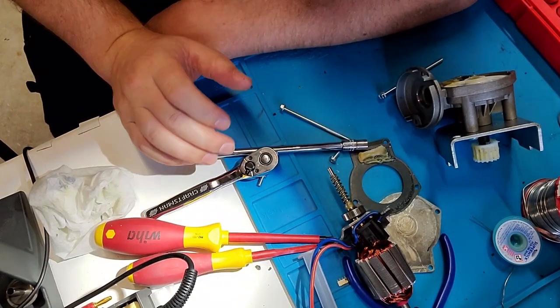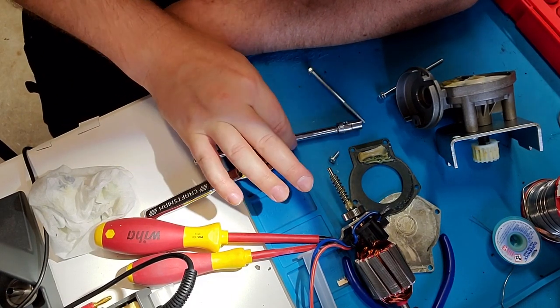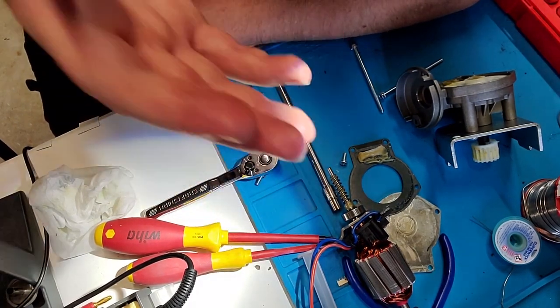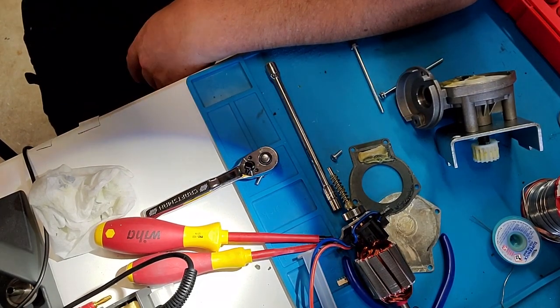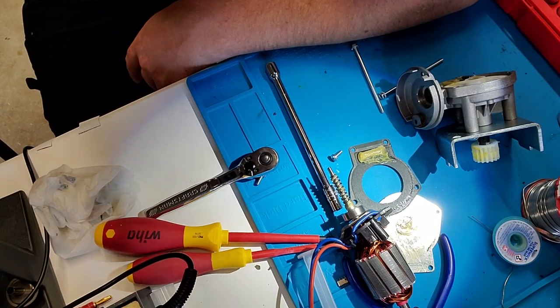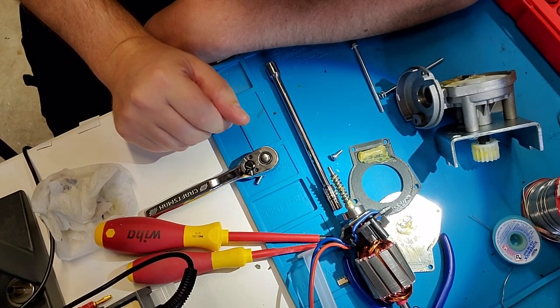This is just another case of somebody ordering parts that they didn't need, and here we are tearing it apart for your leisure, because why waste it? I've already changed out the part according to what somebody said they needed, and here we go. The part was just fine.